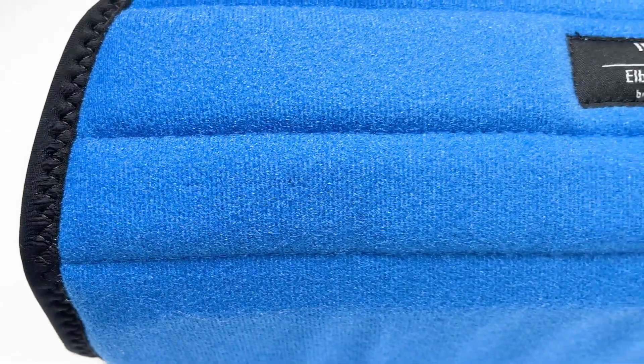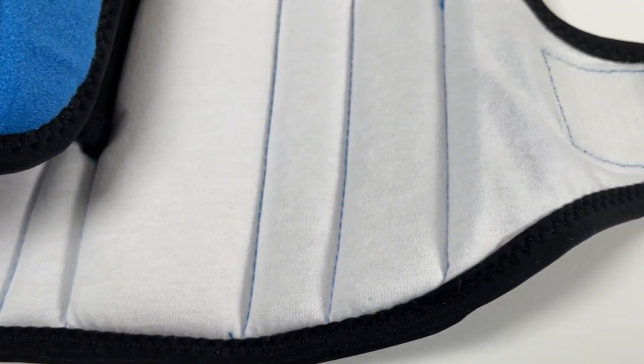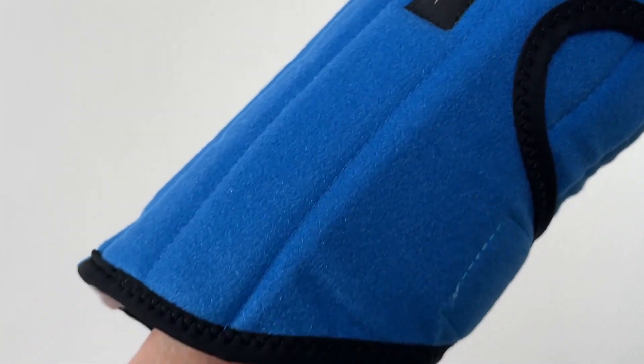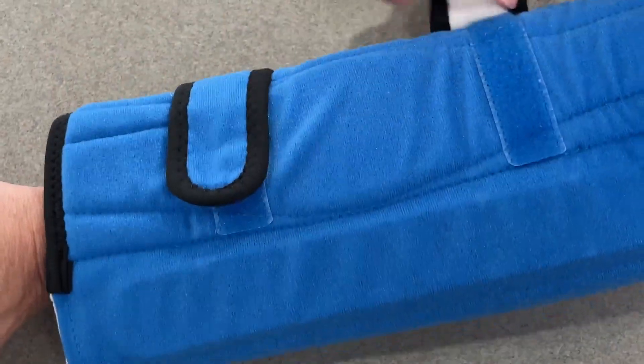The soft fabric and breathable foam keeps your arm completely warm and the cotton lining allows skin to breathe. Elbow support comes with many valuable features including a dual hook and loop strap closure for a universal fit.